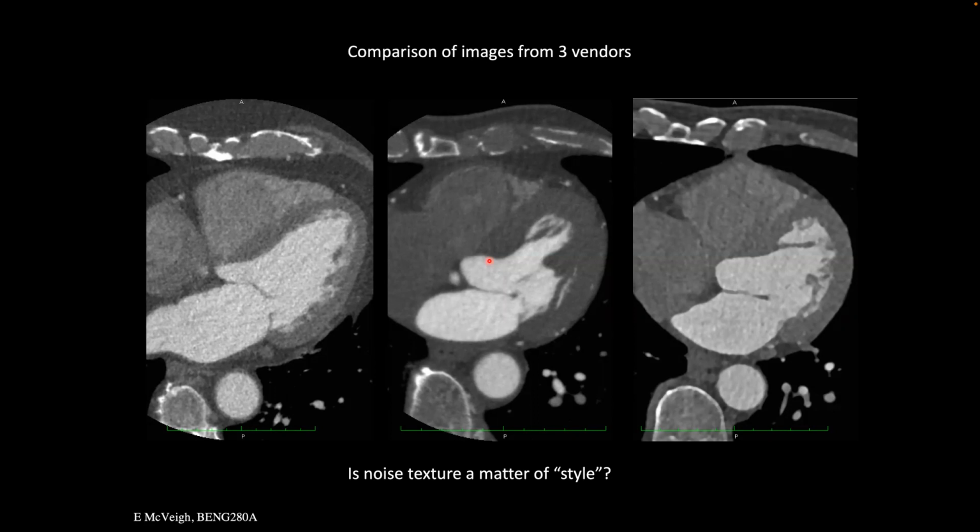So we have this ability to change sampling rates. But when we get the data, as a vendor, we understand that this noise is really complicated and we try to reduce the noise, right? And increase the fidelity of the signal by saying we have a higher signal to noise image. We can manipulate the data to make that happen.